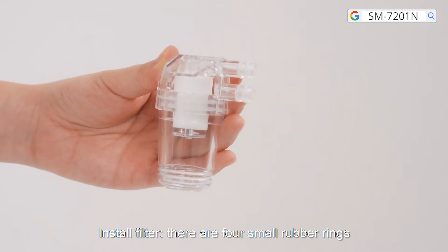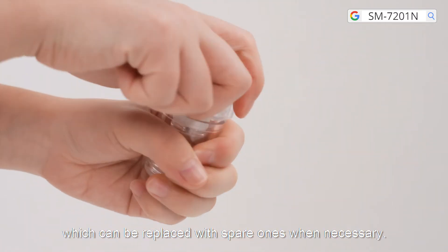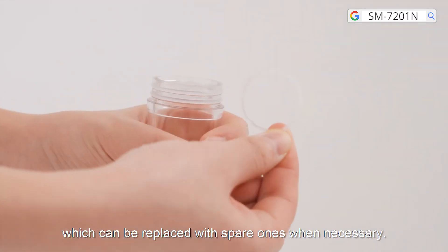Install felt. There are four small rubber rings and two large rubber rings on the felt, which can be replaced with spare ones when necessary.